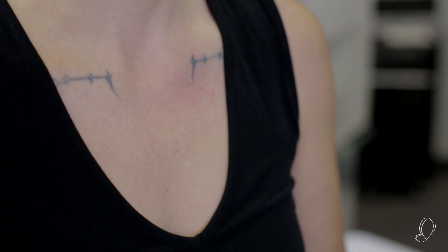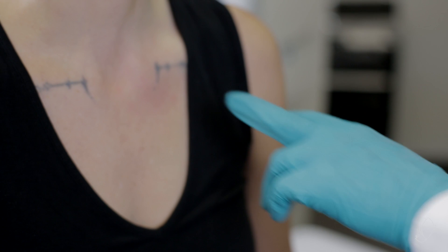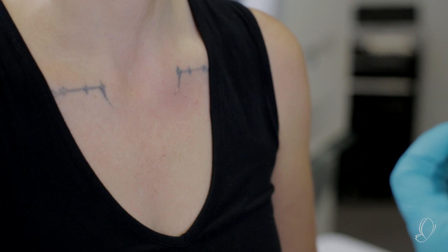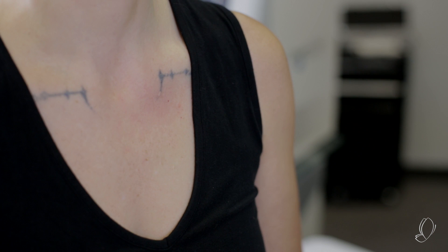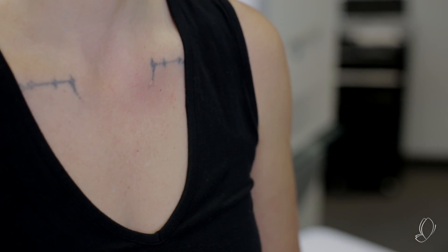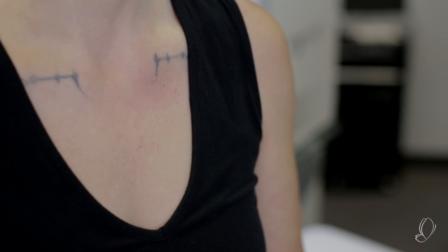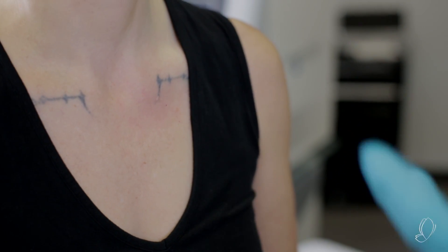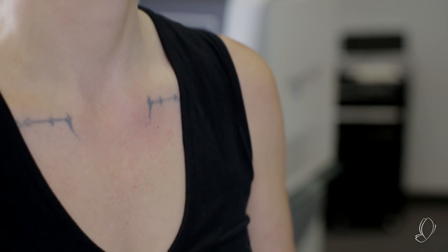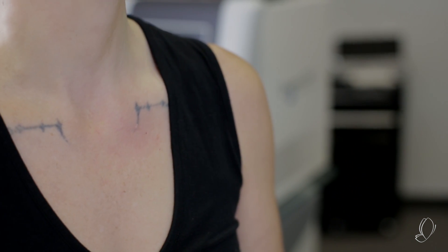What you're looking for is frosting. We don't want it to be too heavily frosted. We want to hear a nice crisp snap. Quite frankly, the patient telling us that they felt something like a rubber band snap lets us know that we're breaking that ink up, breaking it into smaller particles, which allows the body's lymphatic system to go in and get those smaller particles where the body can then excrete them over the next four to six weeks.